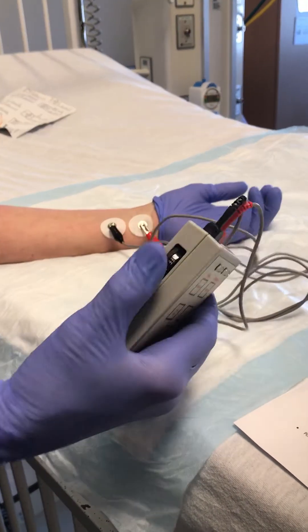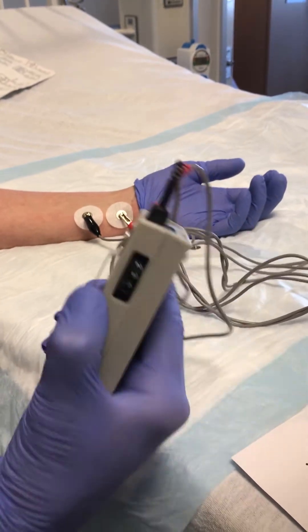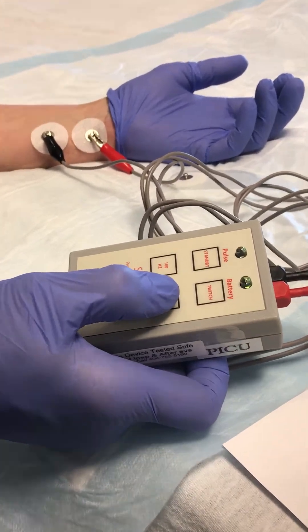Turn the stimulator on. Start at a low setting — three is low — and try to elicit the train of four.